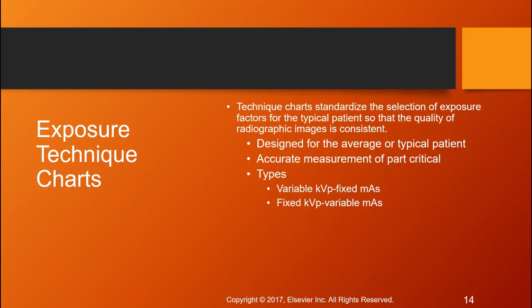Okay, we're going to talk a little bit about exposure technique charts. This is in chapter 13 of your Bushong book. And we did not get into this in lecture, so I just want to touch on this for you. Okay. Technique charts standardize your selection of exposure factors for a typical patient so that the quality of radiographic images is consistent.